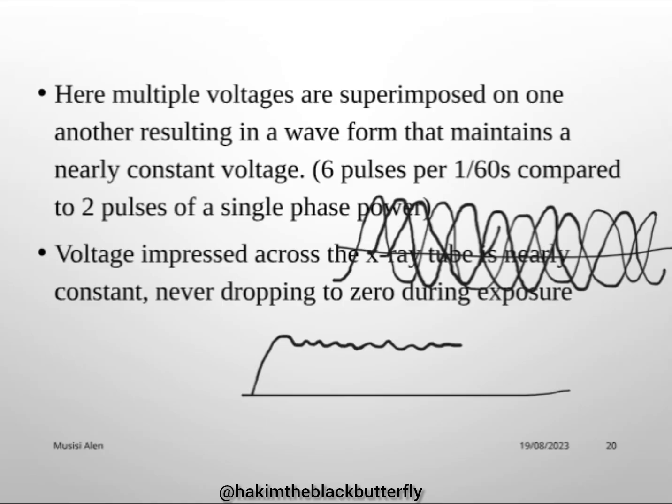Of course, high frequency generators can work on both single phase and three phase power. But since three phase power is costly to bring on site, we use single phase power supply and high frequency generators that can work on that single phase power supply.